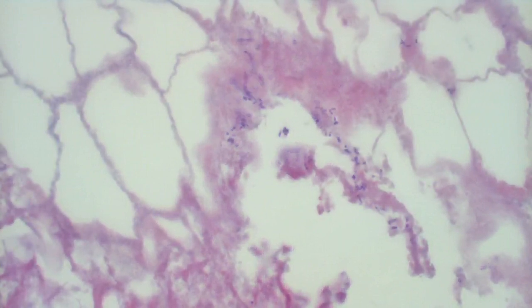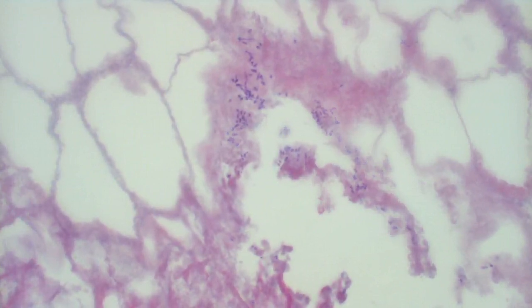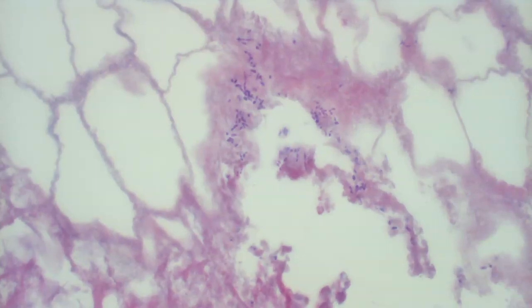They look kind of like cocci or rods. They do look like they may be fungi or something. I'm not sure those things are totally real. They are real, but whether they're really part of the process or not is kind of up in the air.